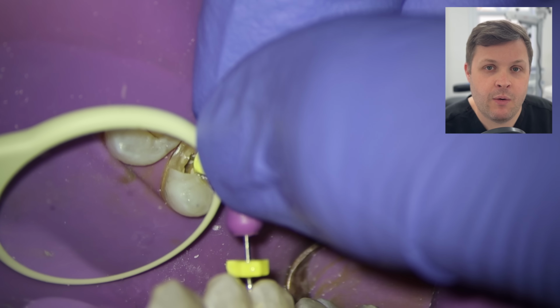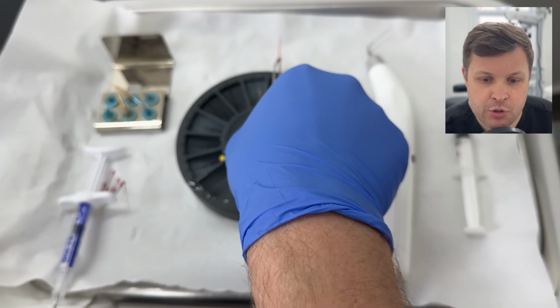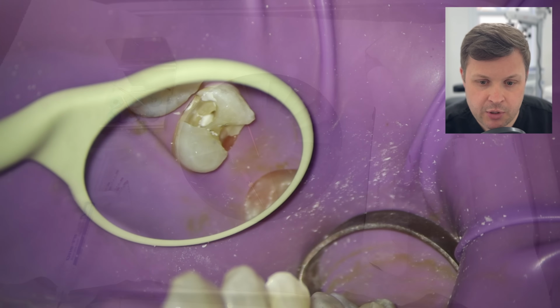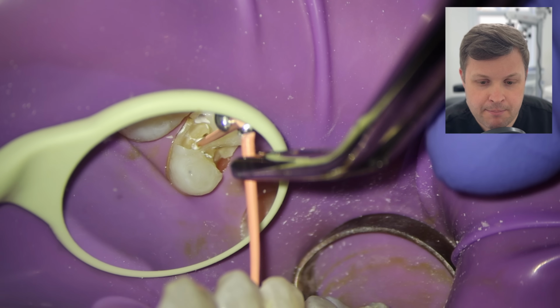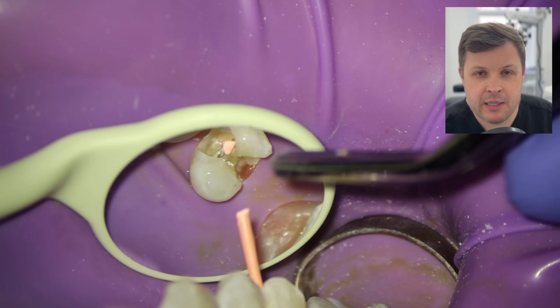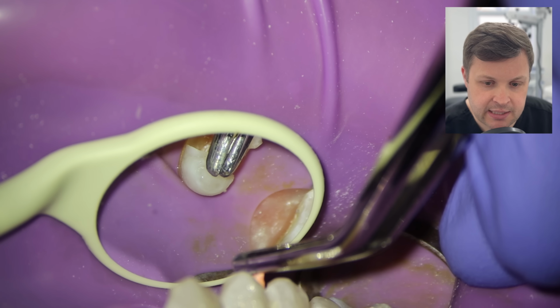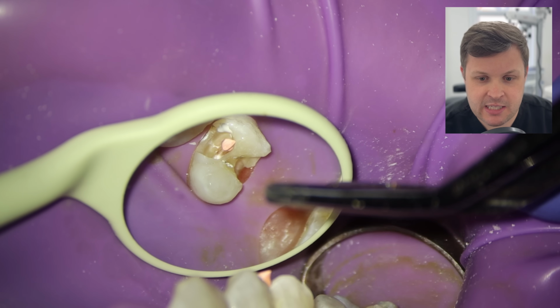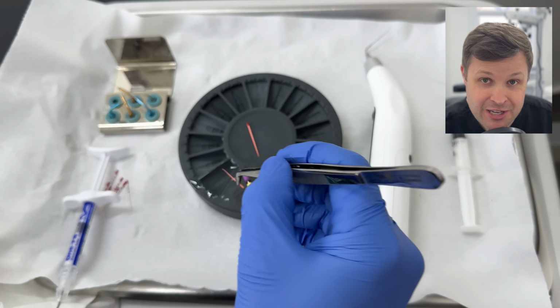We're then going to pick up our prepared GP cone, and then we're going to just very, very, very gently push this GP cone to length. And what I'm looking for here is two things. I'm looking for the bit where I have cut the GP cone off to marry up with the point at which we've measured our working length. And also I am keeping a keen eye on the palatal aspect of this pulp chamber just to see if this fills up nicely. And we can see that the obturation, the sealing material is sort of pushing into this space. And we're going to prepare the palatal accessory cone, shall we say.